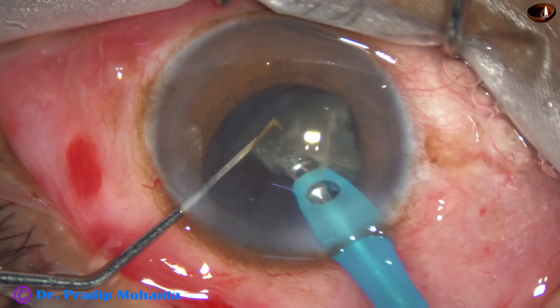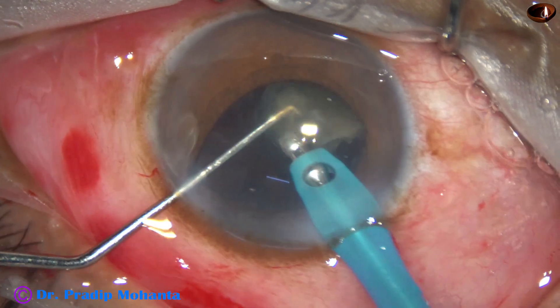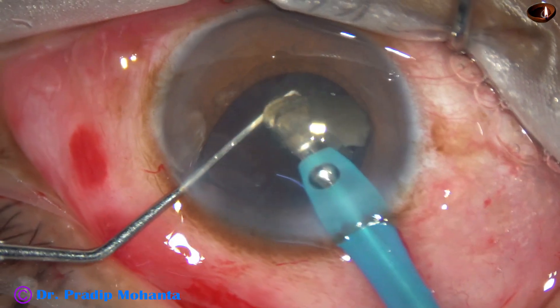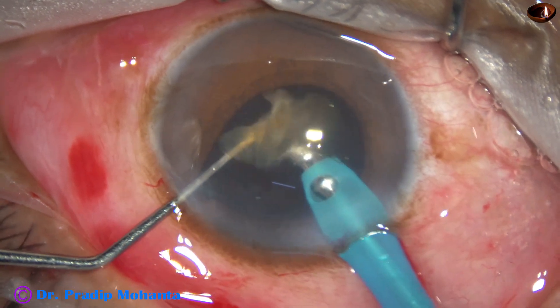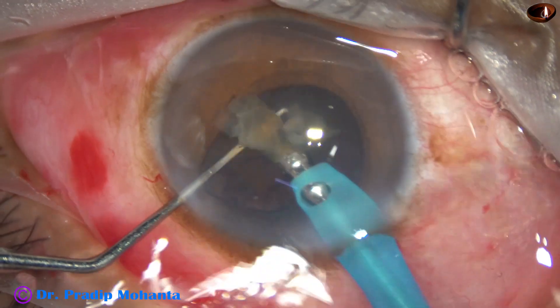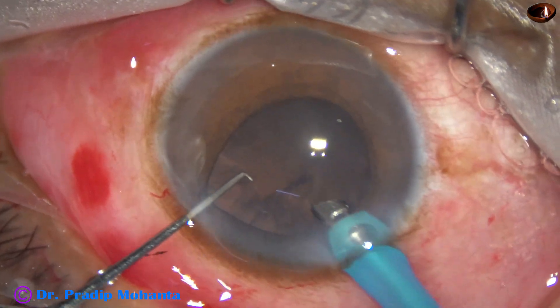This is the last portion of the nucleus. At this time, ultrasonic energy is 60 percent, flow rate is 35, and vacuum is 350 millimeters of mercury. The nucleus has been nicely removed.